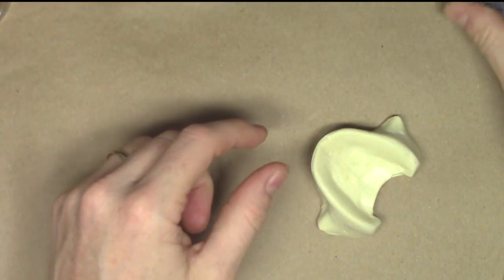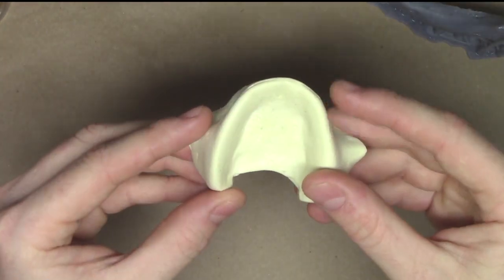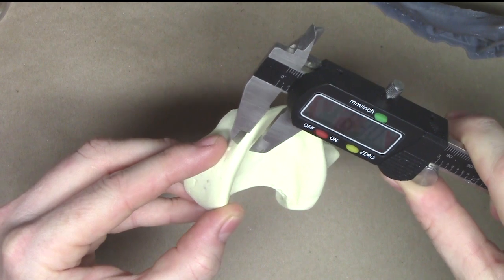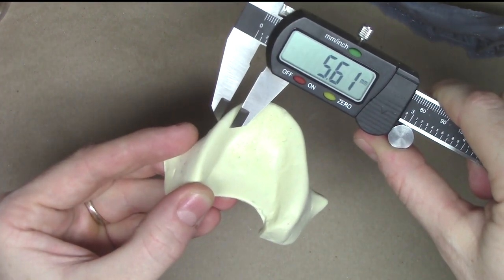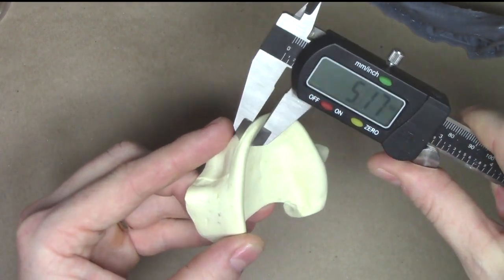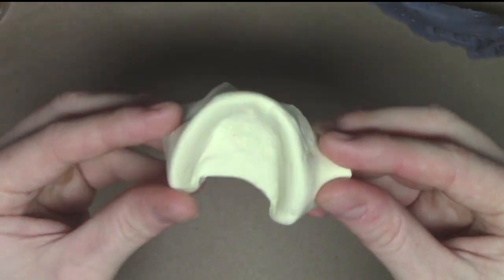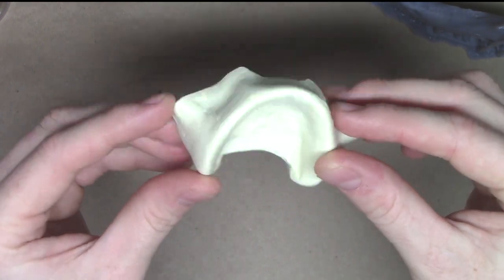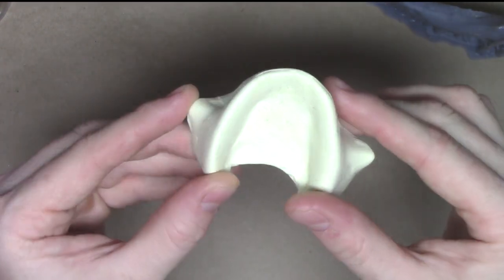Now, when we compare and contrast that to this case, where this is obviously just a little sawbones type of maxillary arch, if this were a patient, and they had a bone volume width of only 5.6 millimeters here at the crest, and if I come more to the anterior, we go down to almost 5.5 millimeters. This would be an excellent patient for this type of indication to use narrow diameter implant stabilization, simply because we have a smaller amount of bone width.